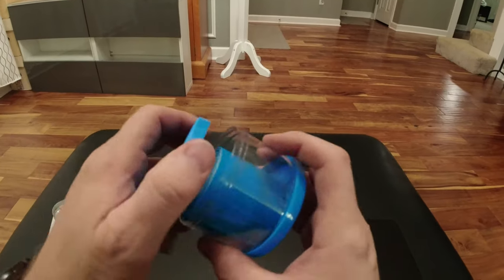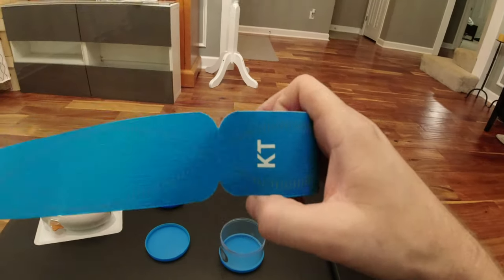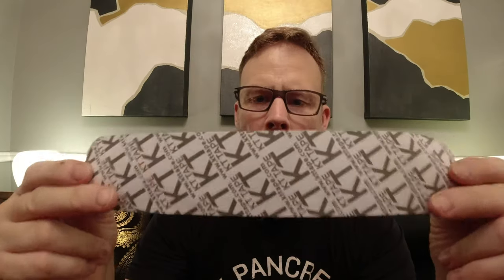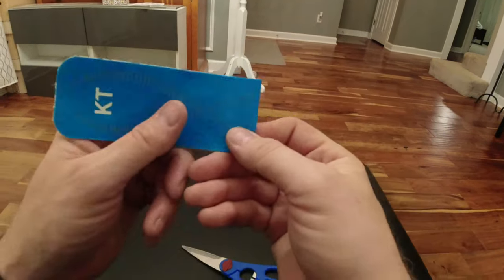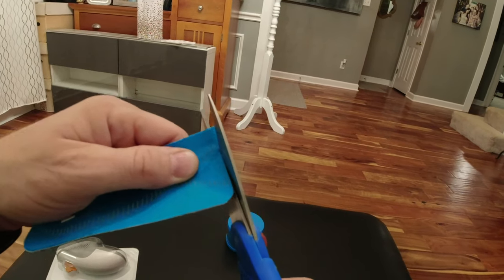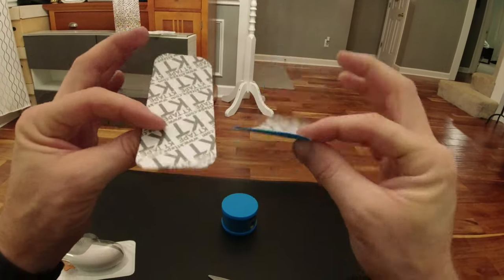This KT tape is pro KT and it is made of nylon. The other one is cloth — if you buy the regular one, it's just cloth. This is in pre-cut strips. Tear off one of these strips and you're going to fold it in half, crease it on the end, and cut it in half right here. You're going to round out your edges so that you have two pieces that are the exact same length with all four corners rounded. The reason you round out the edges is so your clothing doesn't catch it as easily and it tends to stick a little bit longer. The rounded edges are huge.